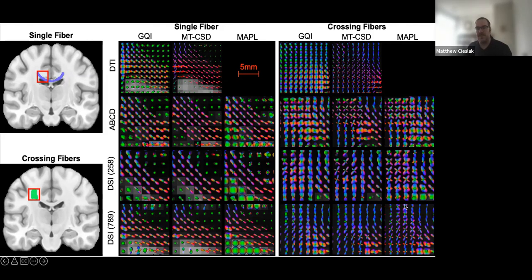I don't have any statistics on this image, but I think it's nice to see how similar all of these results actually are. And I think the ability to go between the different reconstruction methods and have everything come out in a directly comparable file format is going to make it much easier to determine how similar these methods are to each other, and perhaps benchmark a little bit when one is more appropriate than the other. We haven't done this yet. So this shows that you can take almost anything and reconstruct it using almost anything. And hopefully this will be used in the future by someone.